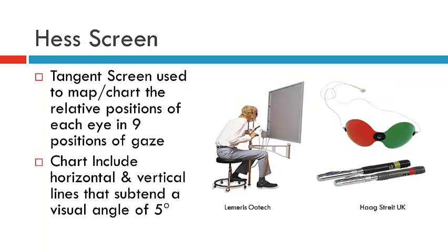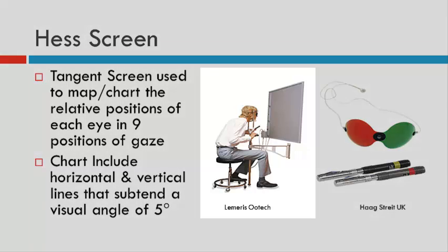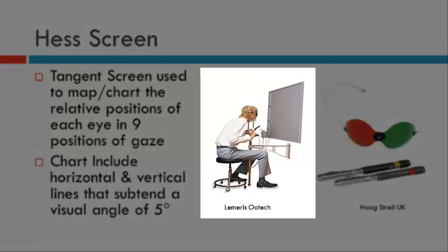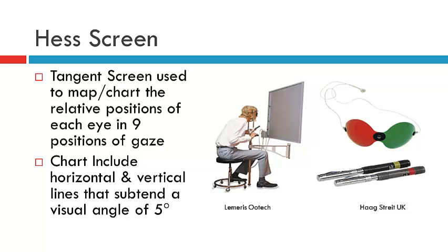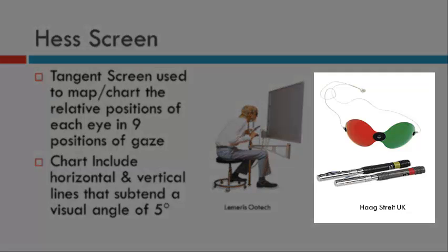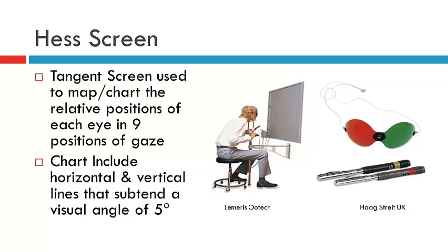The HES screen consists of a tangent screen, which is used to map the relative positions of the eyes in nine positions. Here we have a patient sitting in front of a tangent screen. The chart includes horizontal and vertical lines that subtend a visual angle of five degrees. In order for the patient to perform this test, they need to be wearing red-green goggles, and we need red-green torches — one held by the patient and one by the examiner.